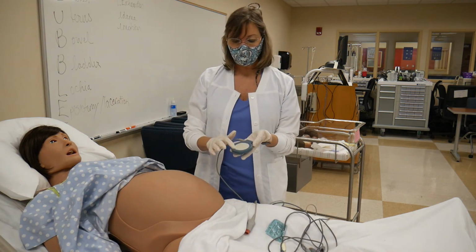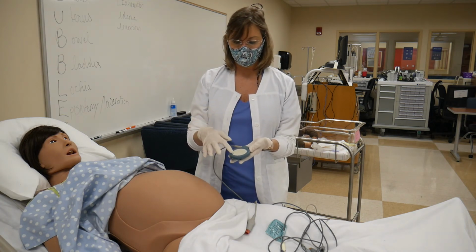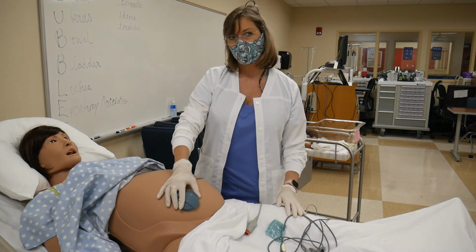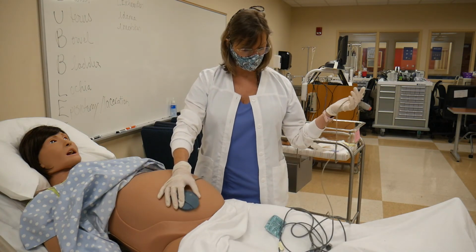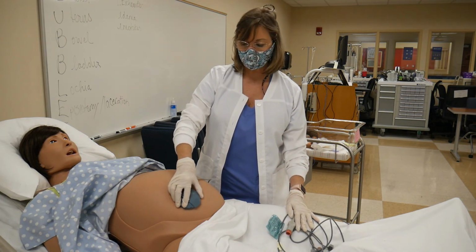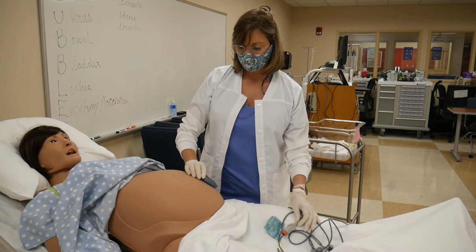So this one's the ultrasound, and you put lubricant on it just like anytime you've ever seen an ultrasound or an echocardiogram or any of that. Put some lubricant on it, and then you're just going to see if you hear the heartbeat. I don't have this plugged in. We'll look at some strips and at the actual monitor, but you'll be able to hear the baby's heartbeat. If you don't, just come over here and slowly move around until you find it.